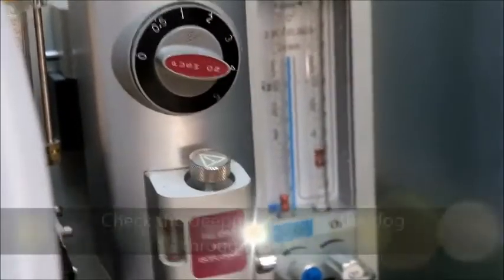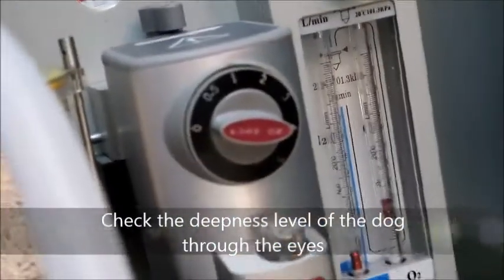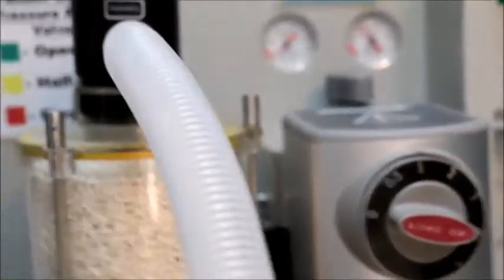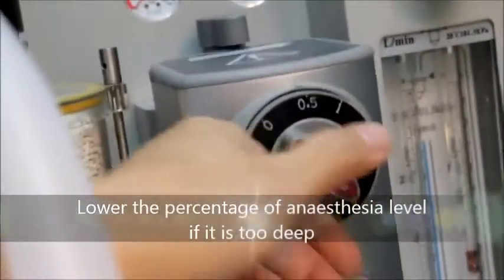The dog is very deep. You can see the eyeball has rolled down. So we have to be careful. Check the eyes, yeah. It's very deep, yeah. If it's very deep, then we will drop to 0.5%.